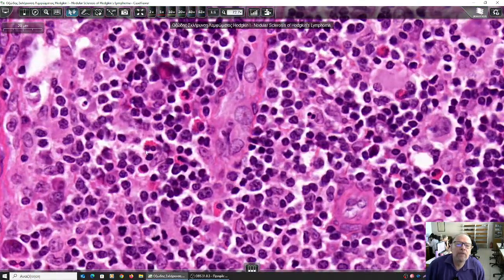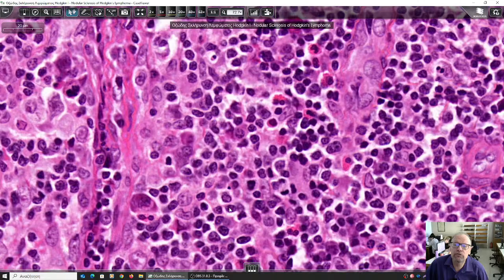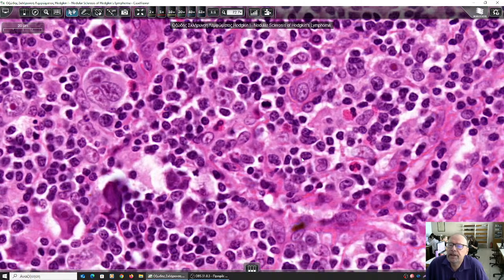Look, a very nice one. What is this one? Another cell. This could be a neutrophil. So we see eosinophils, and this one has a lobulated nucleus. But here is a plasmacyte. What are they doing there?